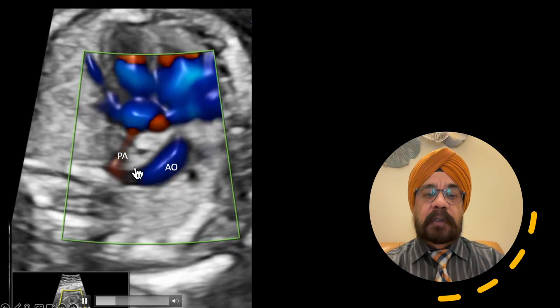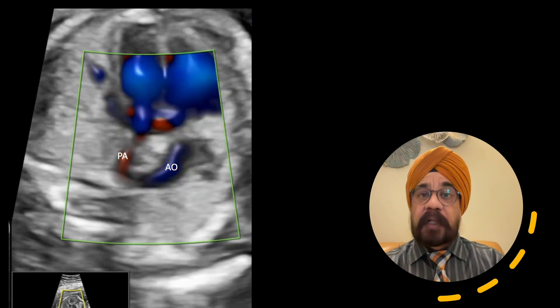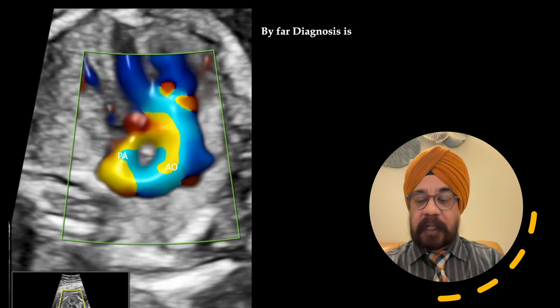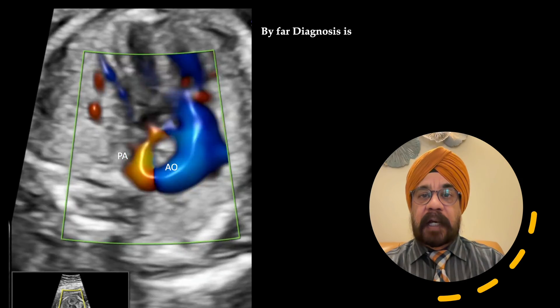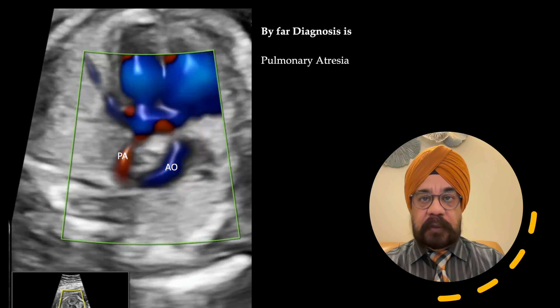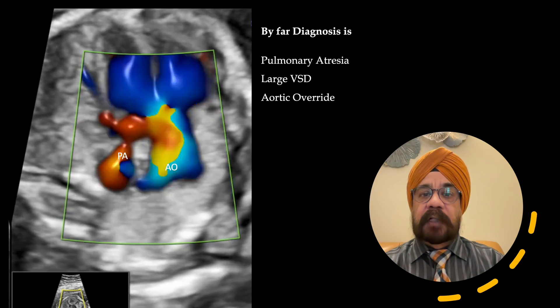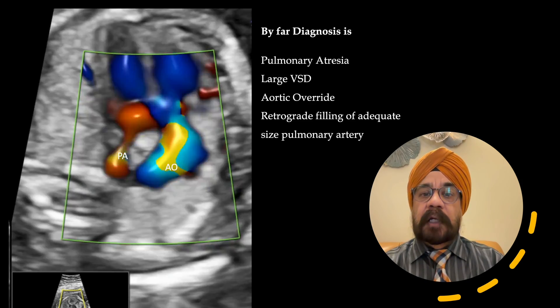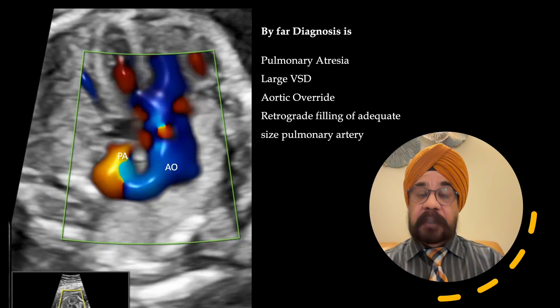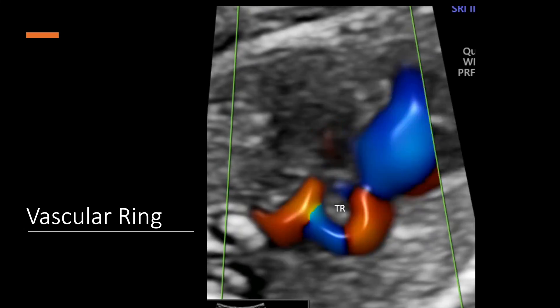Right-sided aortic arch with a left-sided ductus and pulmonary artery flow reversal. The diagnosis so far is pulmonary atresia — you did not see the pulmonary artery arising from the RV. There is a large VSD with aortic override and retrograde filling of the pulmonary artery. The size of the pulmonary artery is adequate; it is not small. But there is more to this case.